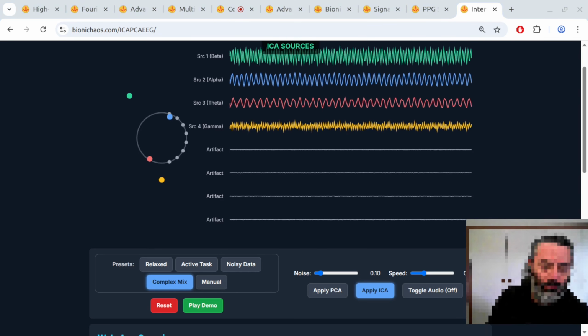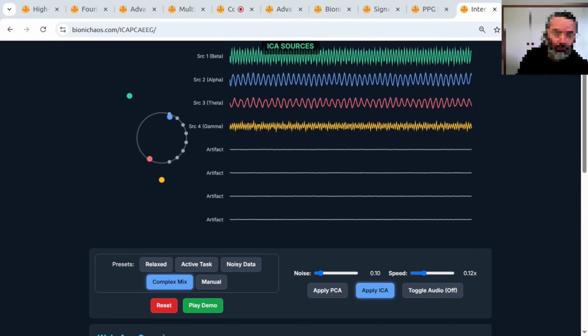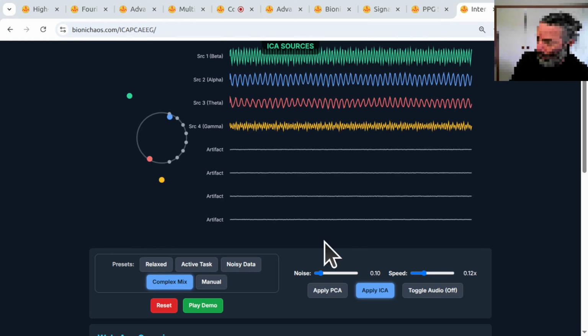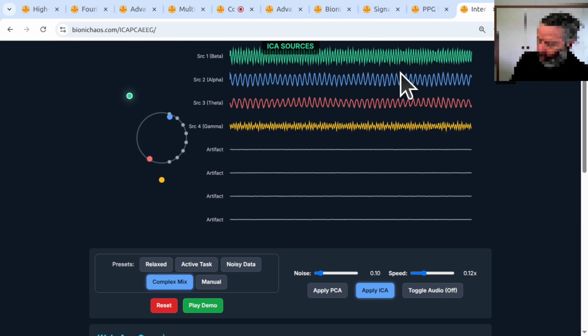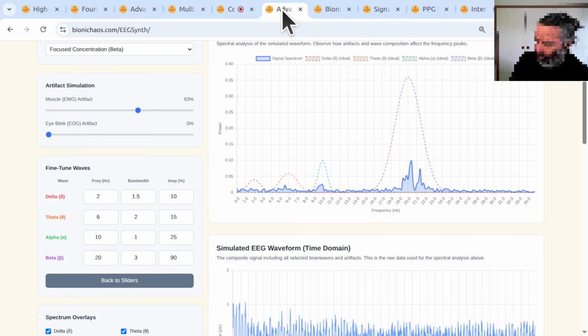Okay, powerful tools for dissecting the signal. But EEG data can look pretty chaotic, right? How do we make sense of that complexity? That's a great point. We often treat EEG signals as chaotic systems. So we use tools from chaos theory and dynamical analysis, things like Lyapunov exponents or fractal dimension measures. Fractal dimension, like Katz, Higuchi.